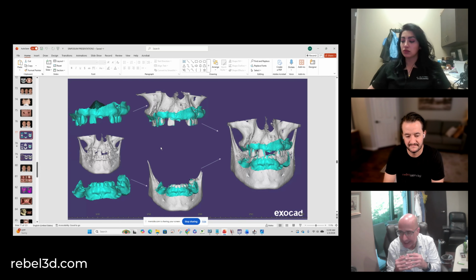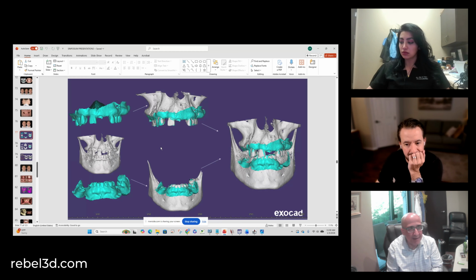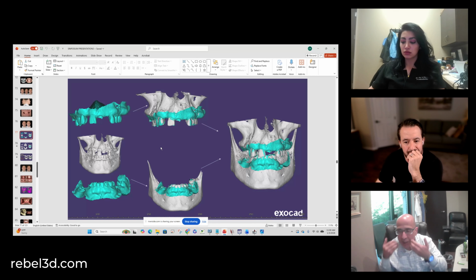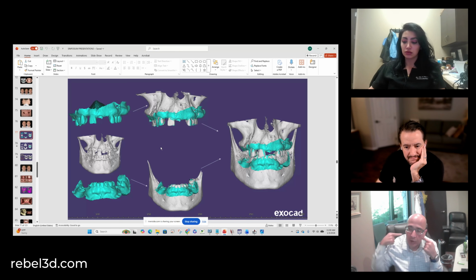This kind of stitching in this kind of bloody environment, with too many things, I would not say most of the time, but a lot of times you have some discrepancy. It's very hard, especially if you have a back edentulous area. Or if you just left two molars in the back or fiducial things, you are counting on this particular piece to this particular piece, it's just dots versus surface area.